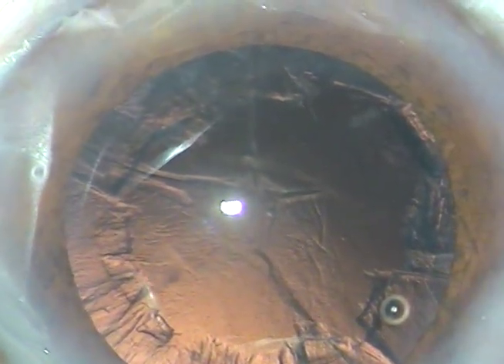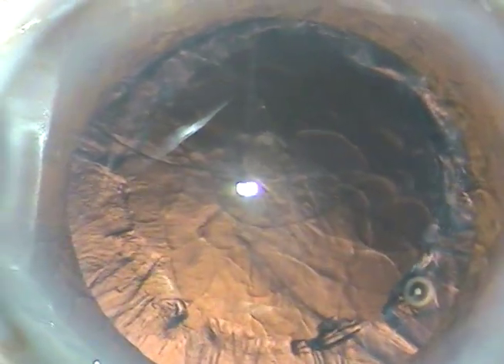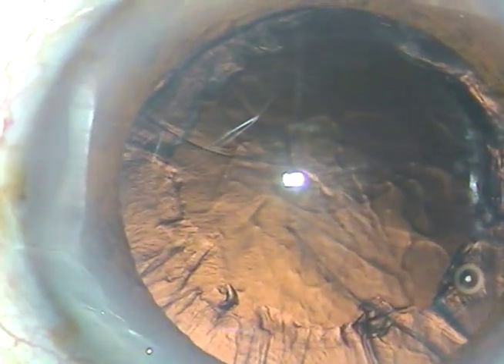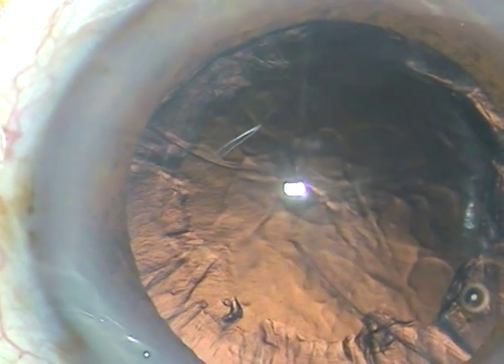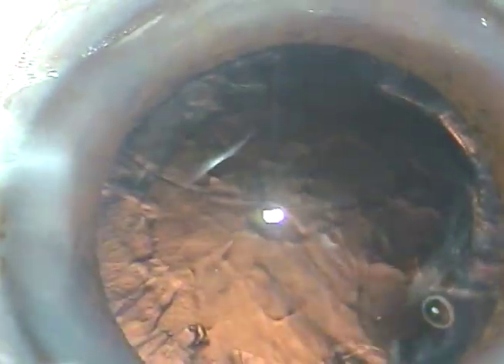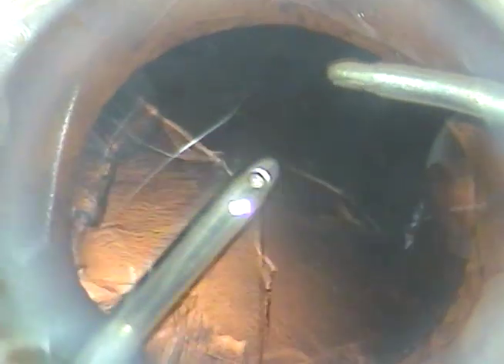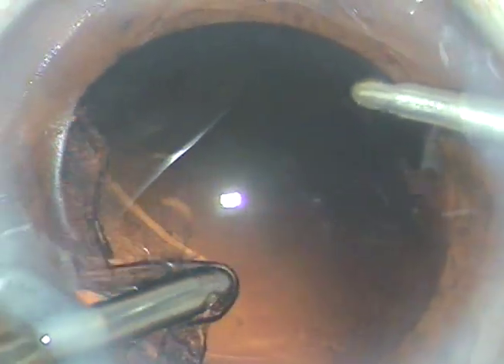We can see some cortical matter. I inject some viscoelastic substance, and now I am going to use bi-manual irrigation-aspiration. I introduce the irrigation and perform additional hydrodissection. Using both irrigation and aspiration, see how easily the cortex comes out — just because of that initial hydration. The cortex is removed.